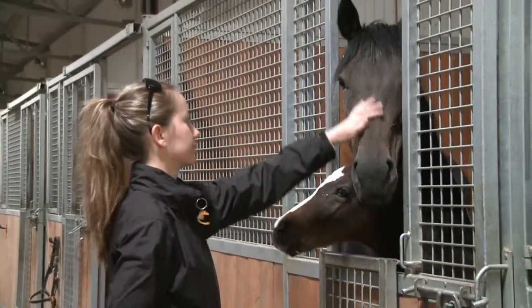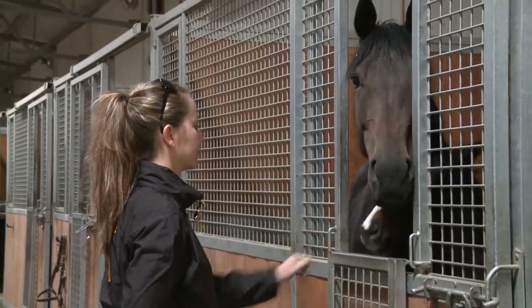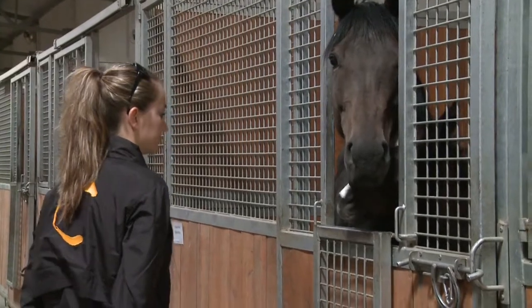I've got some different settings as far as the atmospheres, the pressure that we can put them under. But generally it's about 2 hours. You can treat a horse in the hyperbaric chamber for 5 days consecutive, and after that point you can start alternating the days. So if they're in for 10 sessions, 5 sessions all at once, and then 1 every other day after that.